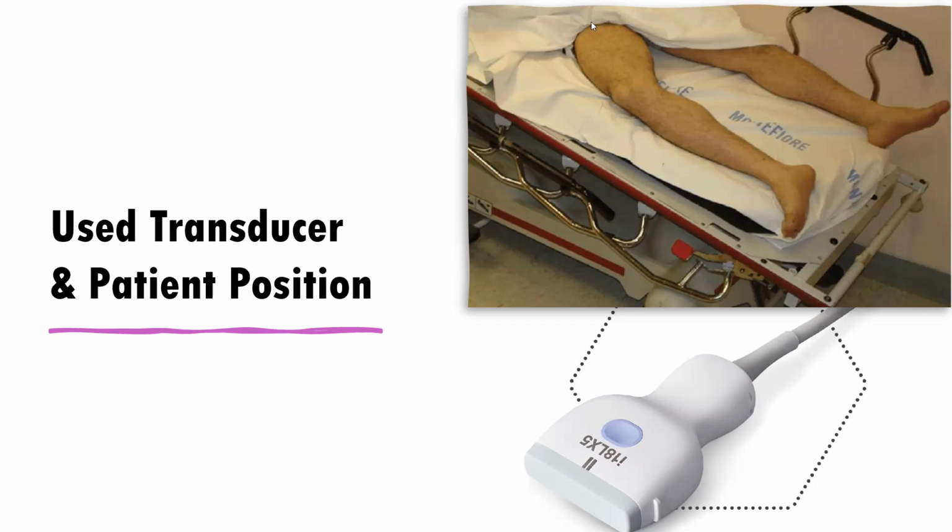So the limb should be open, and the patient should lie down on the bed in this way, so that you can approach very easily. The transducer should be linear, and an attendant should be present, maybe your assistant or a relative of the patient, during scanning.